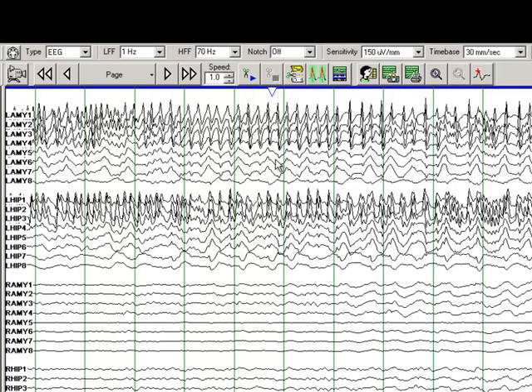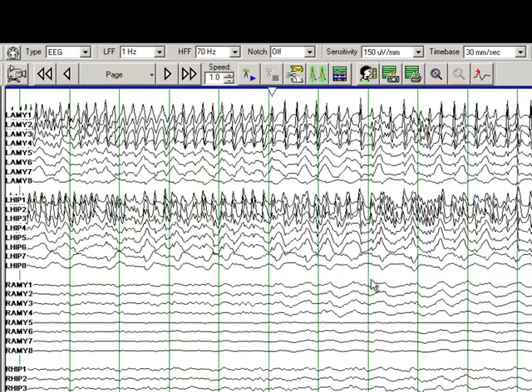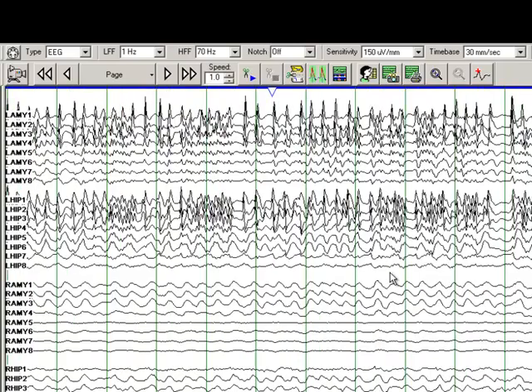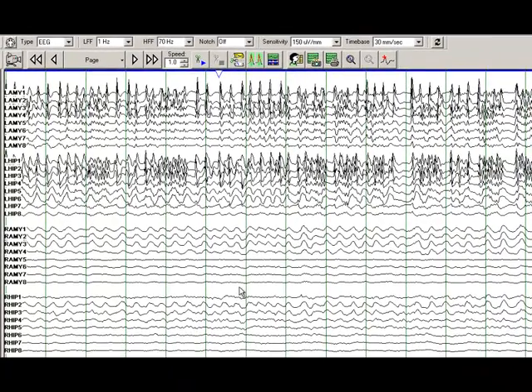In fact, you can see a field that is far more extensive than what you saw at the beginning. And at this time, there is some rhythmic activity noted in the right amygdala and right hippocampal contacts 1-4 as well.